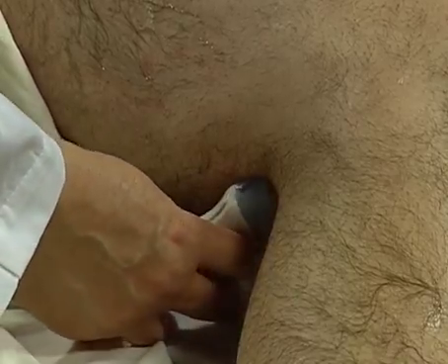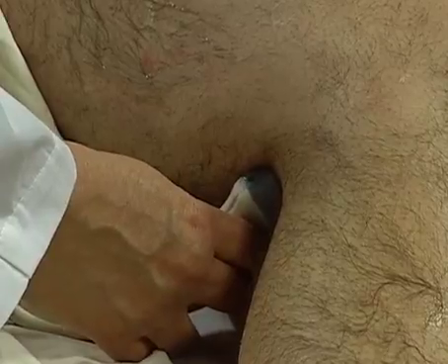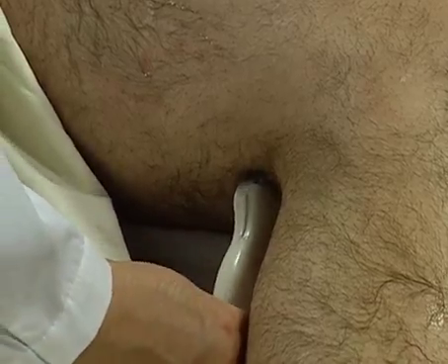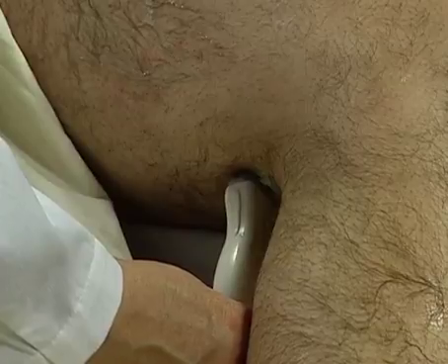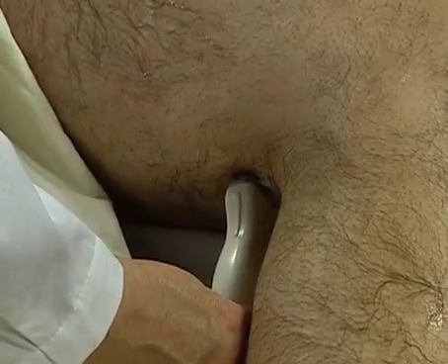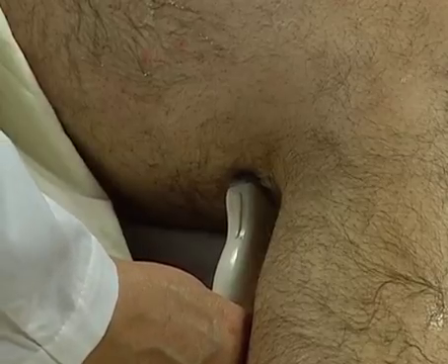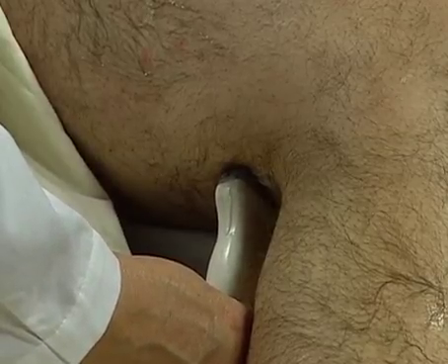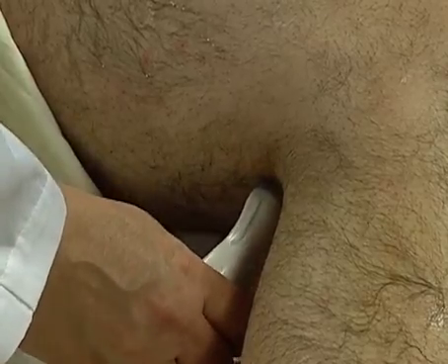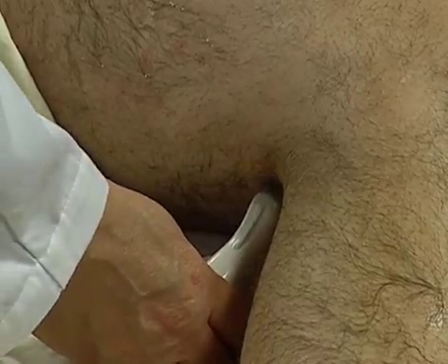And you can see my hand just sort of coming in here, and we should be able to see the popliteal artery pretty well. If I want to, I'm going to pitch back and angle back towards, let me try to move my hand out of the way, angle back towards the lower thigh. And this is the approach we'll use to try to evaluate perhaps the distal SFA if we had any question, because this is where it's going to come through the adductor canal. And we'll pick up the popliteal artery, and we'll take some shots of that as well.